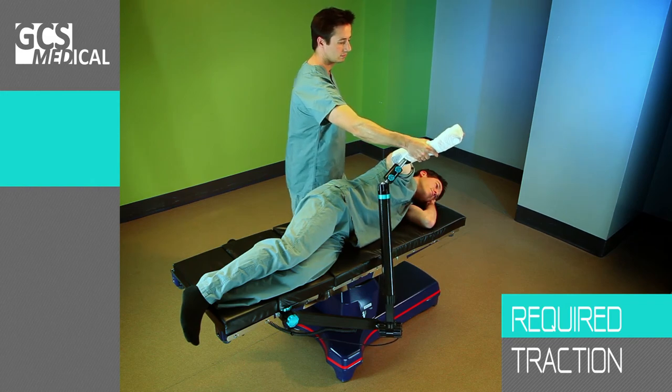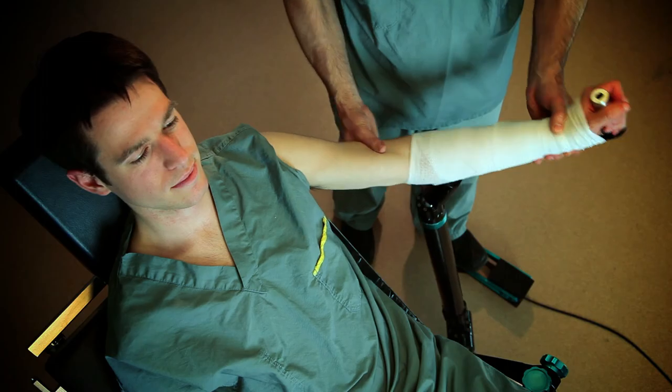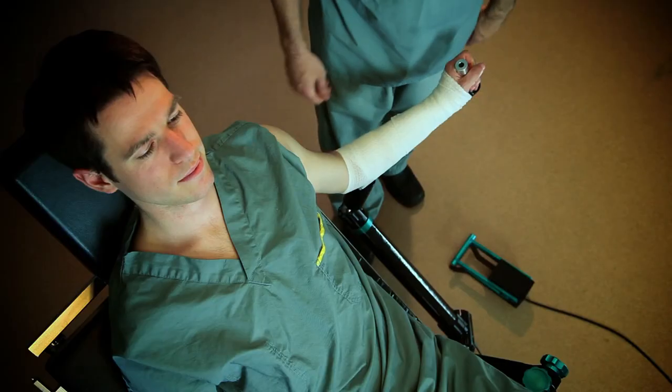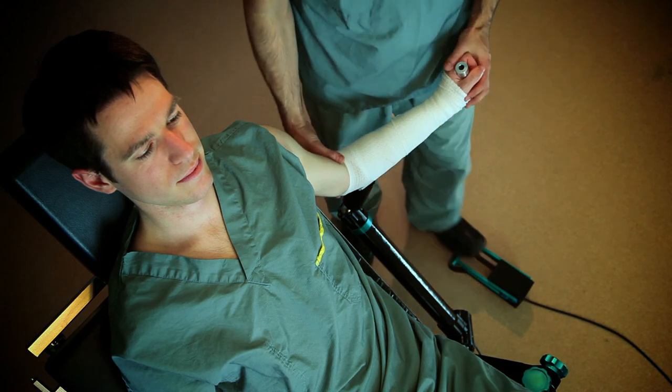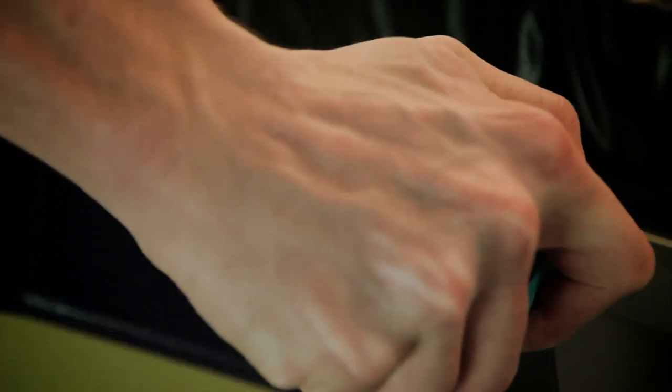In beach chair position, the Assist Arm preserves the traction required to distend the joint for Bankart repair surgeries or cuff repair, and maintains the position during hammering for shoulder replacements.